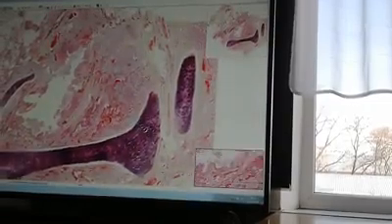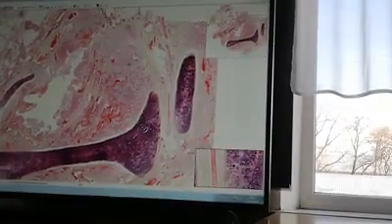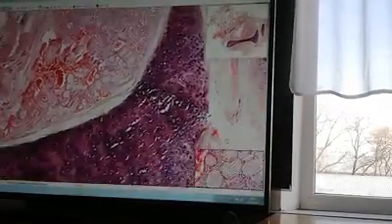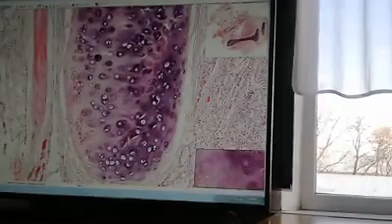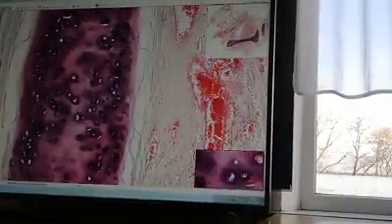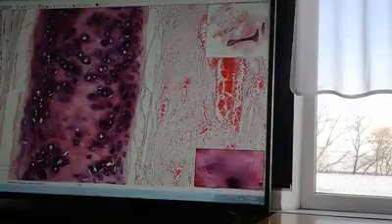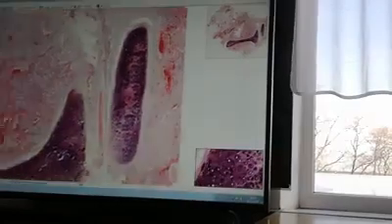But the important changes can be seen here in the bronchus. First of all, purple areas. This is the typical view of cartilage tissue. So it's cartilage, normal cartilage, without any pathological changes. Just try to remember its appearance, and next time when you see this microscopic structure, don't mistake it for any pathological formation. It's the normal appearance of cartilage. Normal cartilage in the large bronchus.